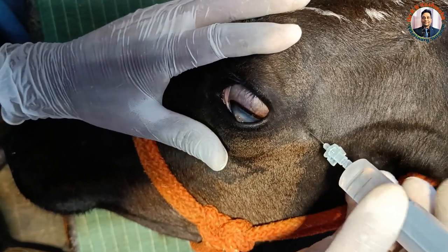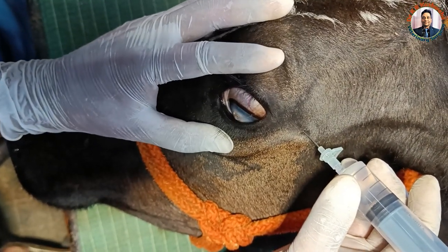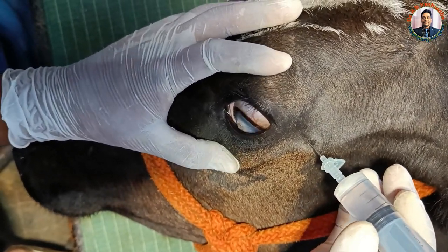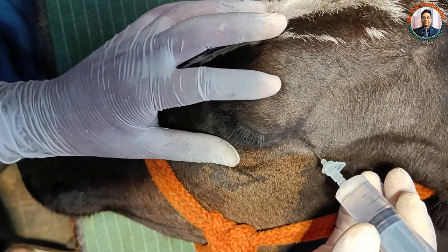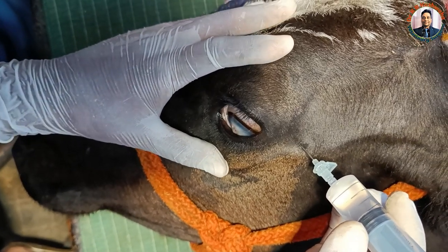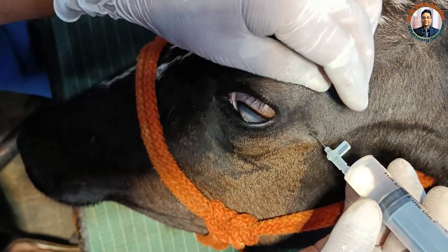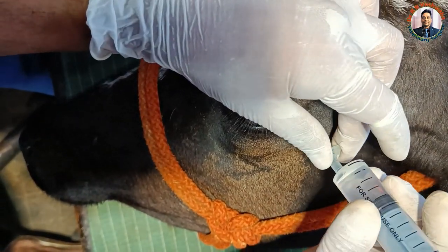In this way, we have injected 12 to 13 ml of 2% lignocaine hydrochloride solution behind the eyeball.